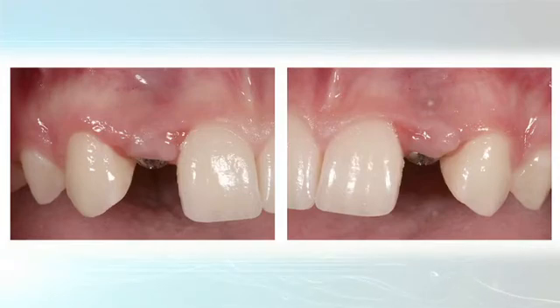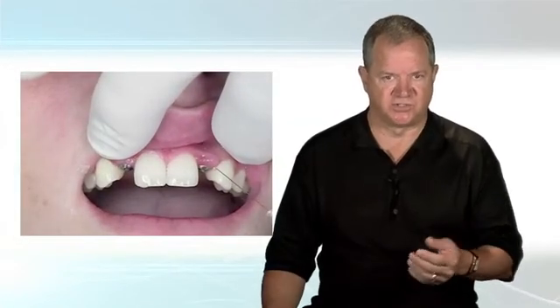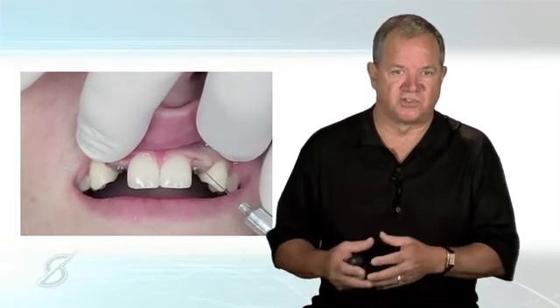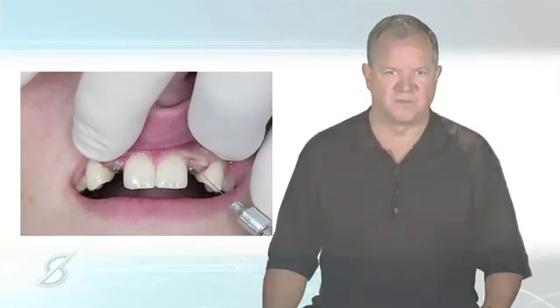So what I'm going to show you now is the actual video of inserting the temporaries. This is the same patient that you saw the video on of making the impressions for the temporaries. And what I do is I inject again right into the papilla until it blanches all the way facial to lingual. In my experience, placing single tooth implant temporaries can be quite uncomfortable for a patient because there's so much compression of tissue. So I pretty much always blanch the tissue like this before I seat the single tooth temporary.